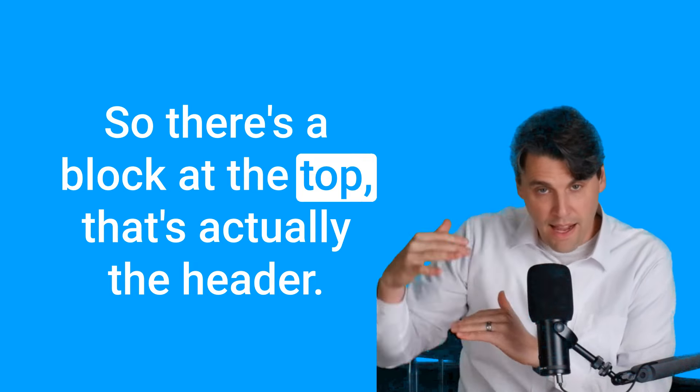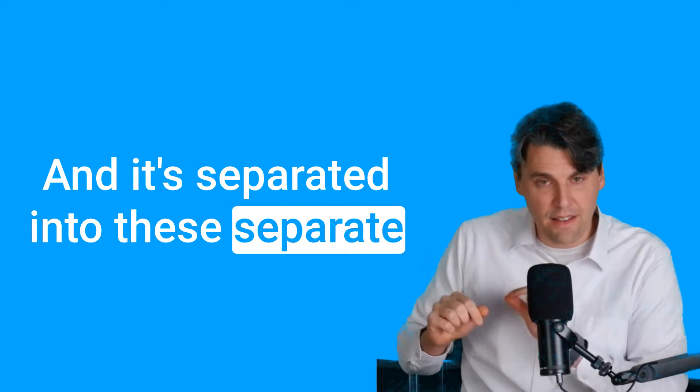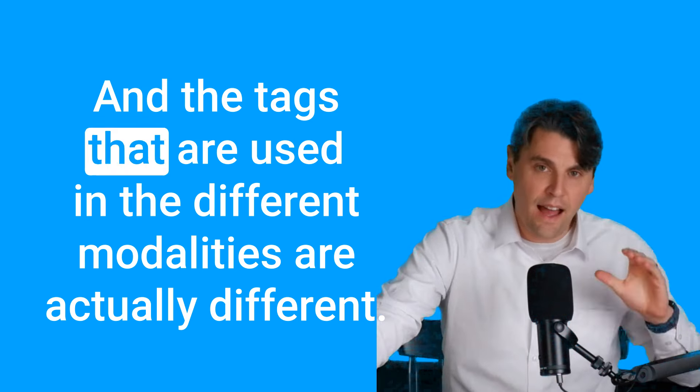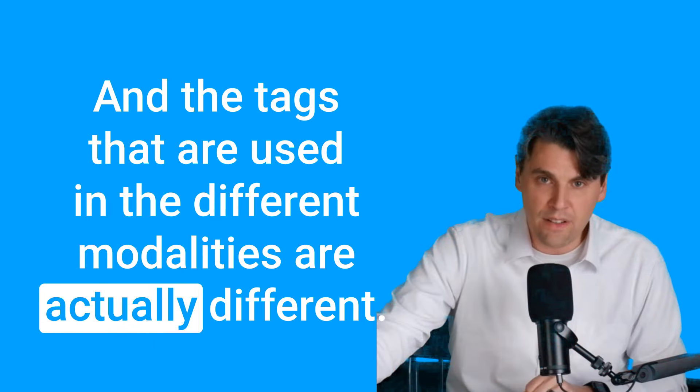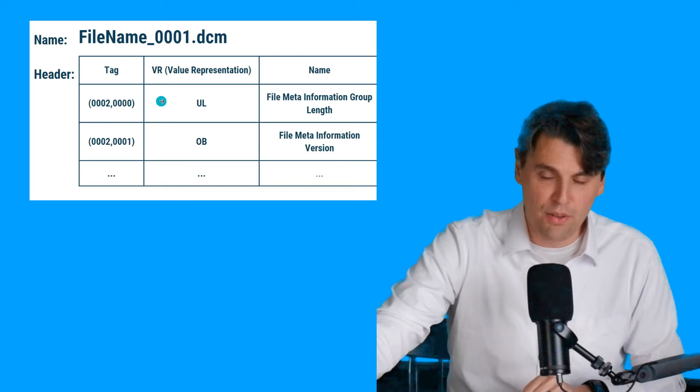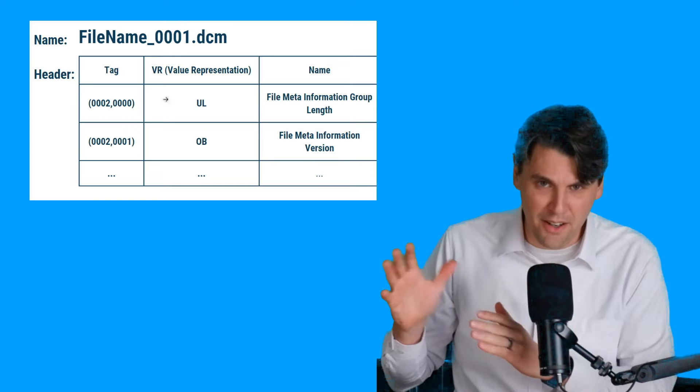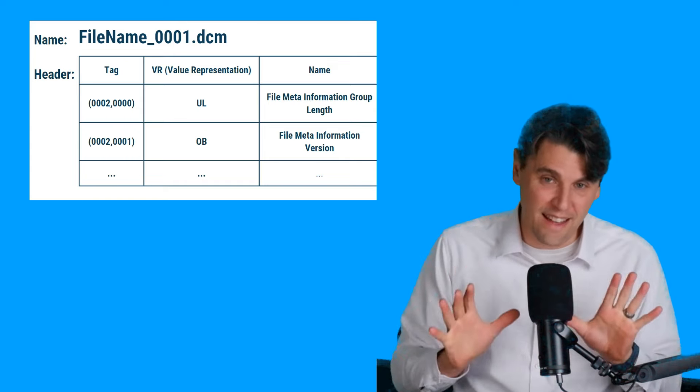So there's a block at the top that's actually the header, and it's separated into these separate things that are called tags. And the tags that are used in the different modalities are actually different. The tags are defined here, and these are defined in hexadecimal numbers. So if you actually open it up, and the numbers look kind of funny because they have letters in them too, that's what's called hexadecimal numbers.